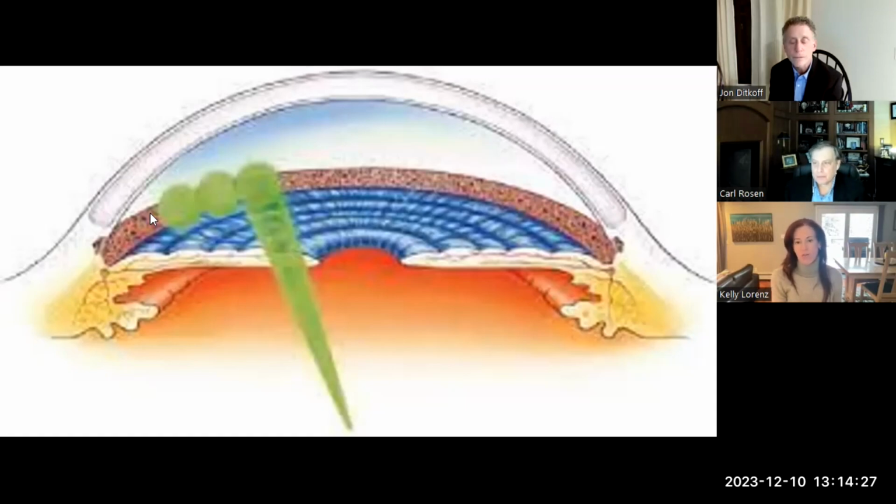Depending on where somebody's initial eye pressure is and what their degree of glaucoma is, sometimes the laser can be performed in lieu of beginning glaucoma therapy. I've done it on people who are on a single eye drop and want to try to get off that eye drop. So sometimes you can expect to be able to take somebody off their eye drops. If somebody's on what we call maximum medical therapy, like 3 eye drops to try to control their pressure, I set expectations realistically and let them know that the laser's not going to be strong enough to get them off all of their medications, but it may be effective enough to get them off at least one of their medications.